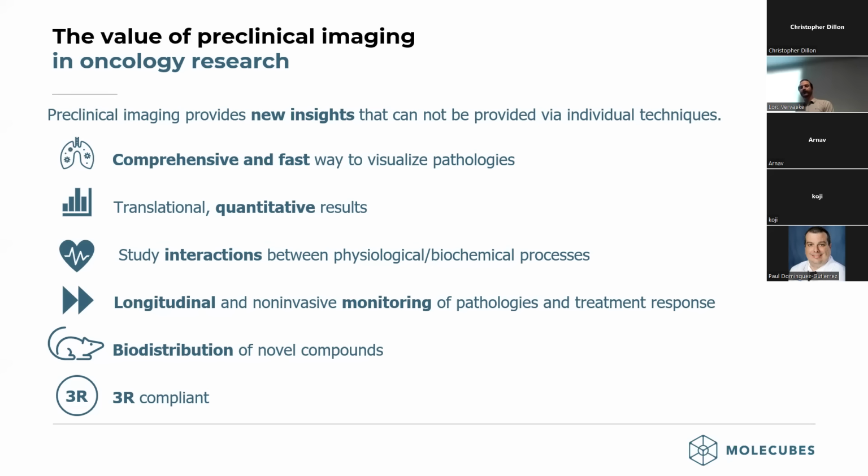A fifth value is the fact that you can have an entire look at the biodistribution of new compounds. So from the administration, the metabolism, to the excretion, new compounds can be fully visualized and quantified.